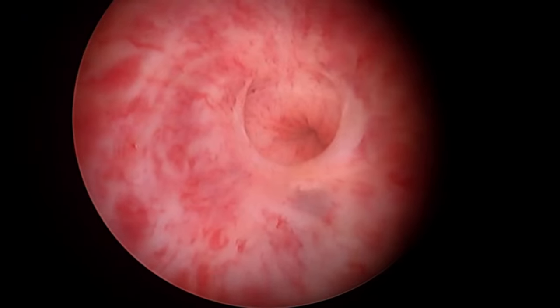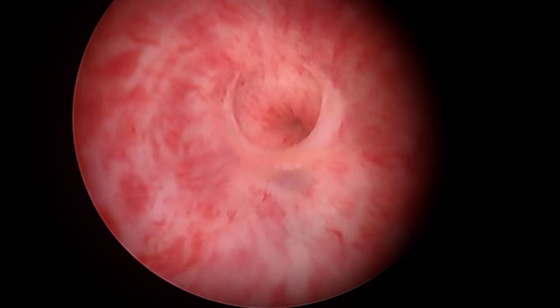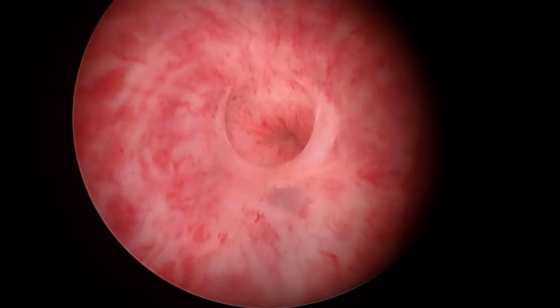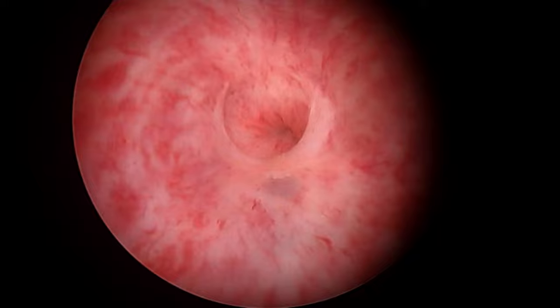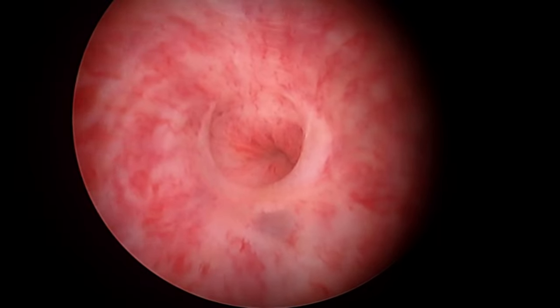In this case, the stricture is short and it's in the bulbar urethral area, which is the area of the urethra that is just ahead of the area where the prostate is.